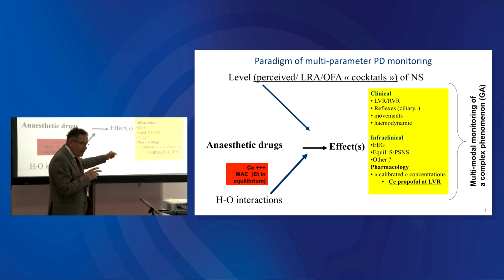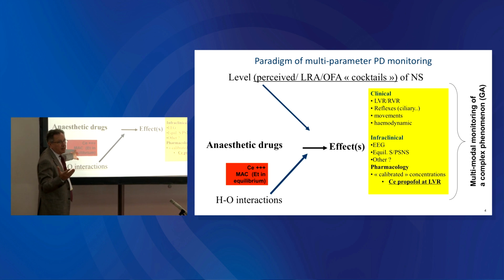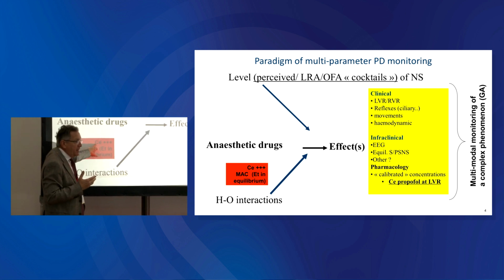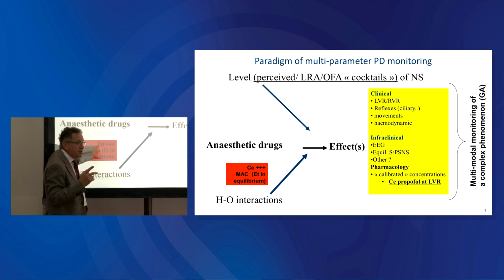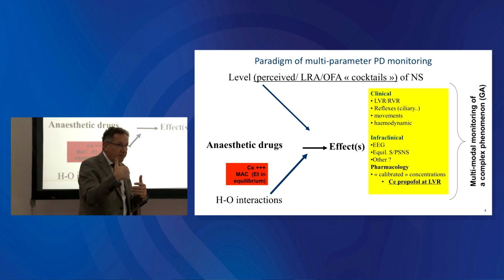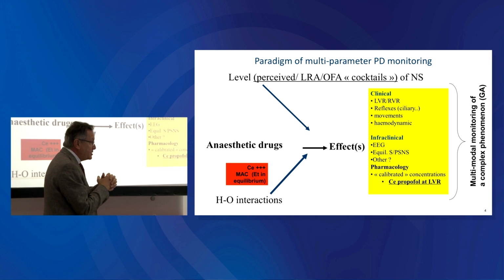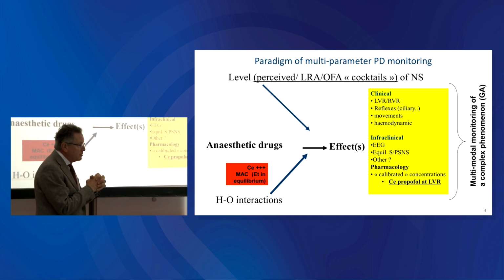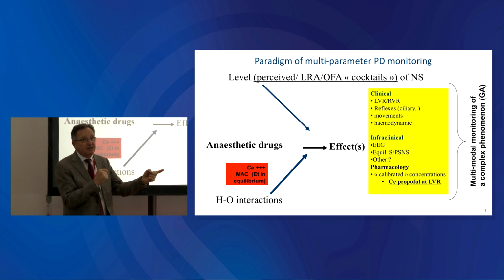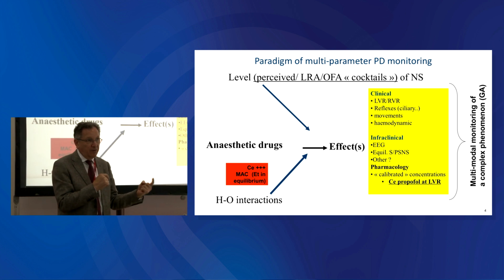And then I put back here the pharmacology calibrated. So here, if I tell you I have a MAC, it's an uncalibrated parameter. If I tell you this is a CE, effect site concentration, propofol 4 microgram per ml, it's uncalibrated. If I know that Professor Sessler, that I put to sleep, lost verbal contact with me at an estimated propofol effect site concentration of 3.5, that becomes an important value for me and Professor Sessler as a patient, because I calibrated his requirements upon loss of response to verbal command.